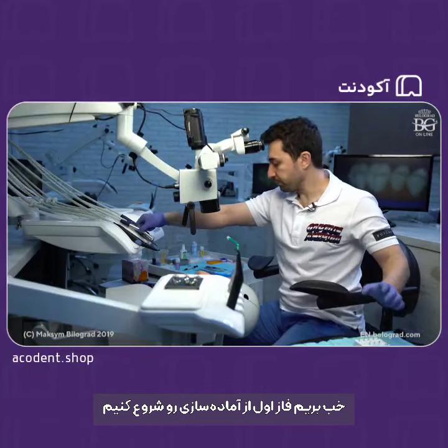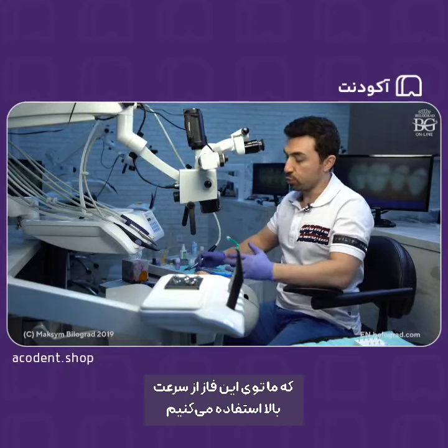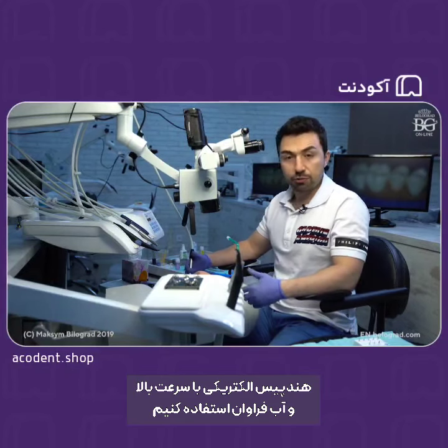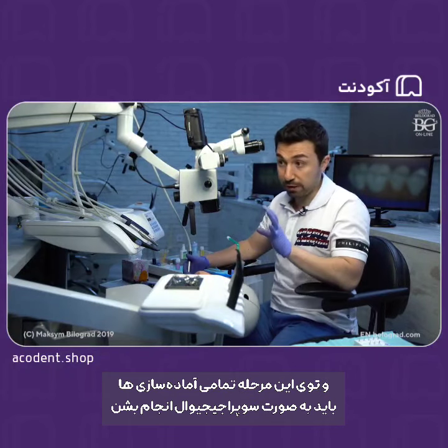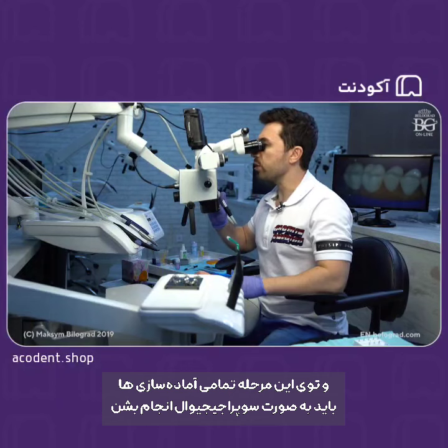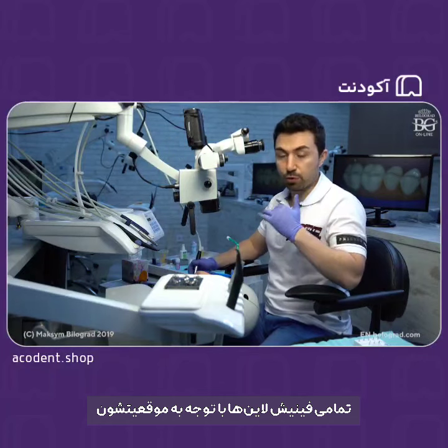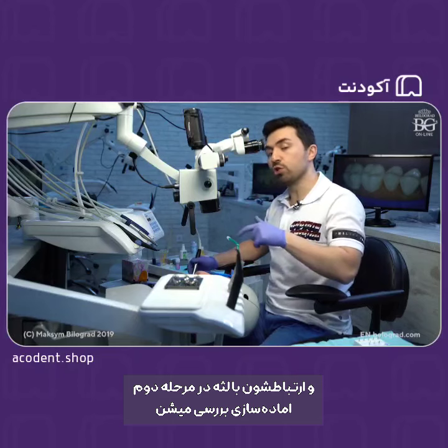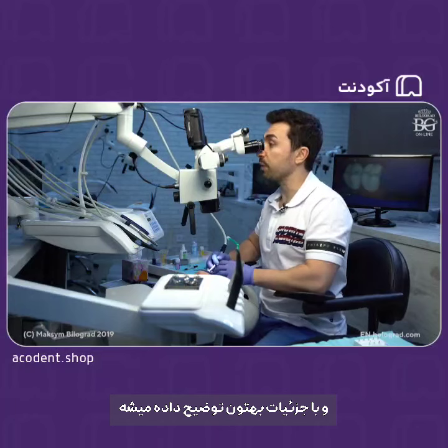Okay, so I'm going to stage 1 of preparation. Stage 1 of preparation is when you are using high speed. You can use a turbine, or an electric increasing handpiece, with high speed and a lot of water, and all of your preps have to be done supra-gingival. All finish lines, considering their position in relationship with the gum, will be given in stage 2, and we will display and then explain them in detail.